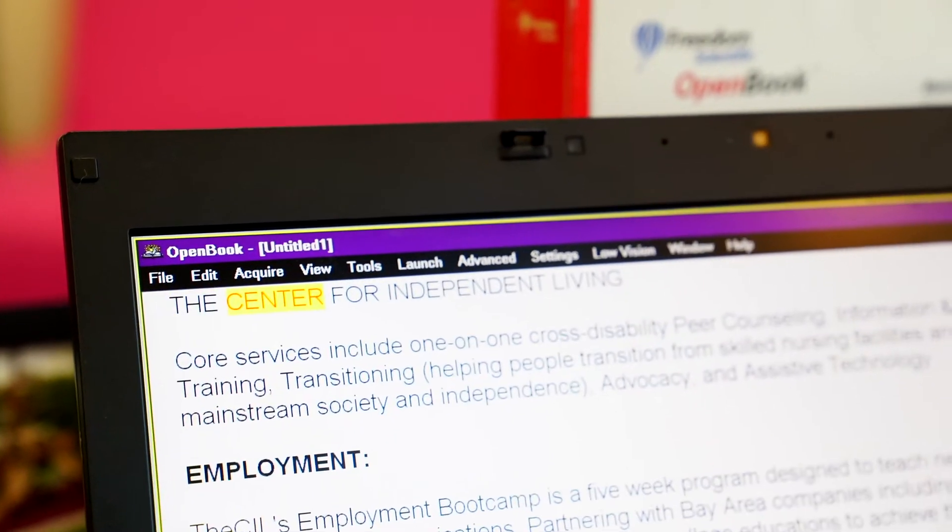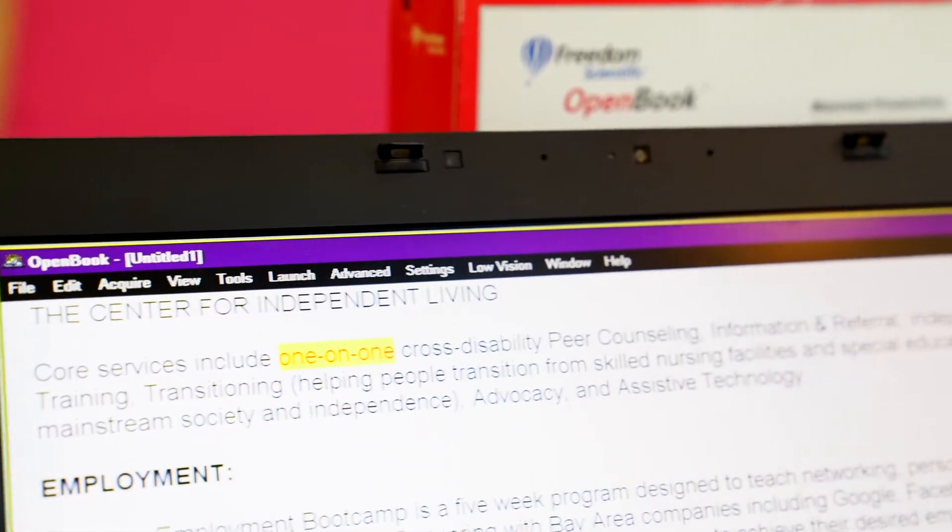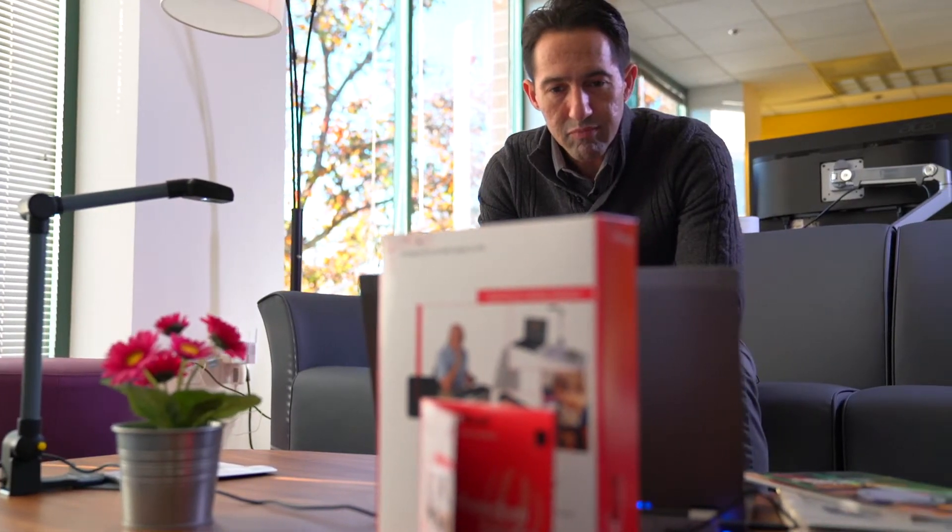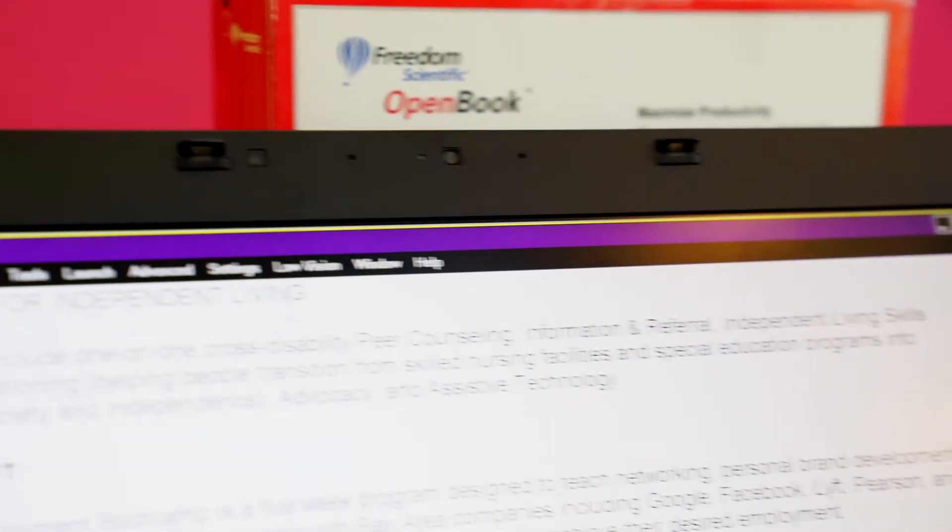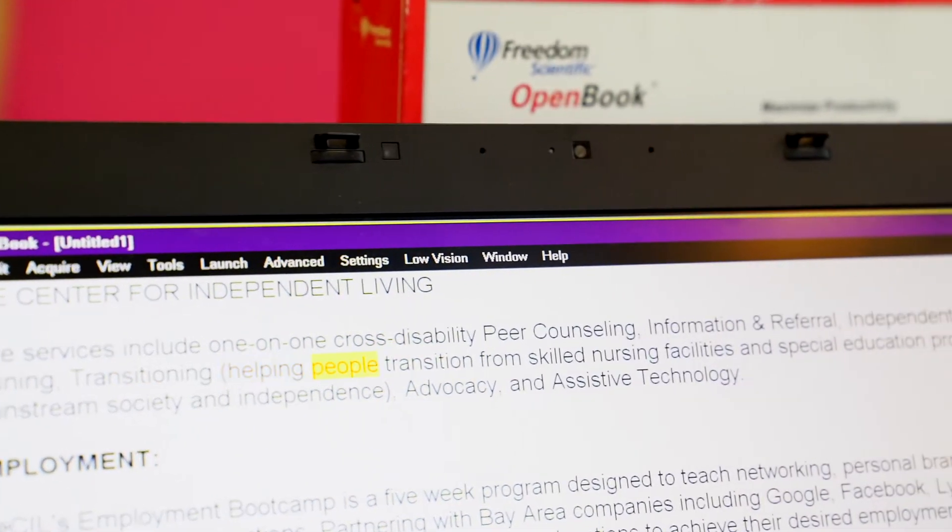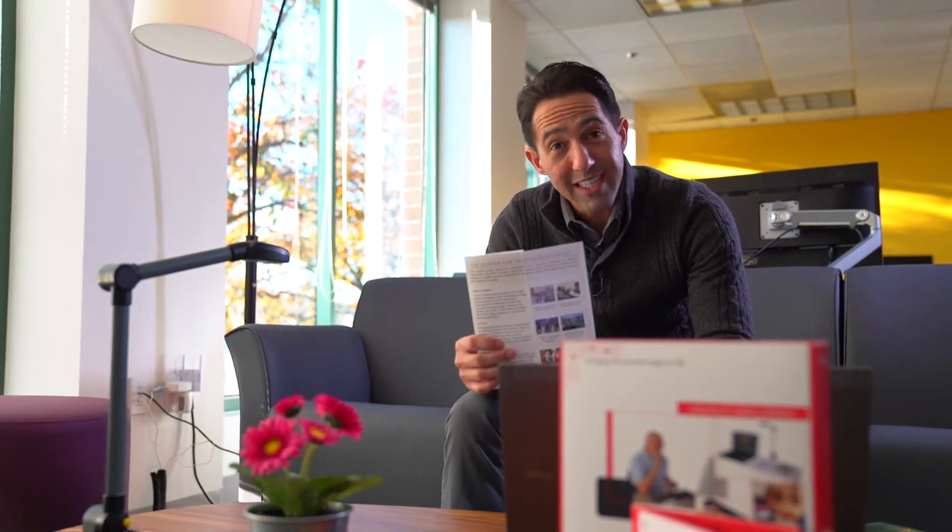Letter one, the Center for Independent Living. Core services include one-on-one cross-disability peer counseling, information and referral, independent living skills training, transitioning, helping people transition from skilled nursing facilities. Well, it seemed to handle the brochure with ease. It was unfazed. That's a term I like to use, kind of fun.